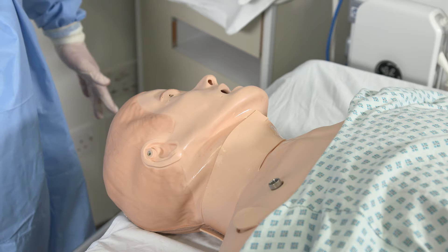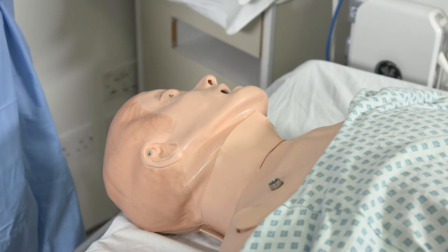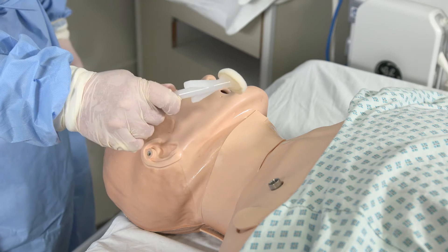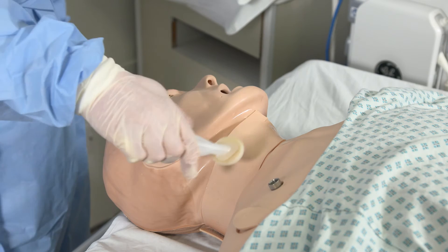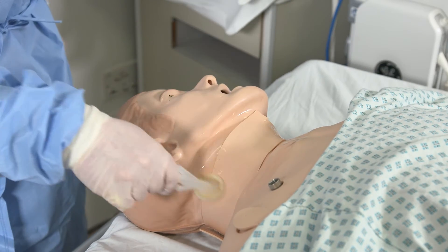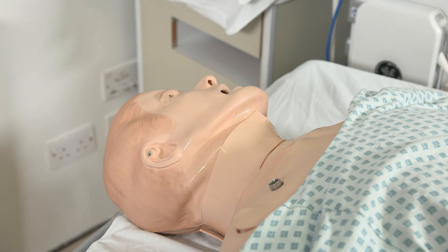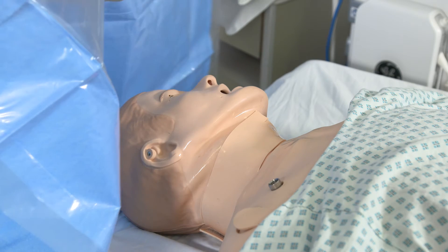Once you have positioned your patient and had a quick scan with the ultrasound to check the patency of the vessel, scrubbed up and set up your equipment, the next step is to clean the site with a 2% chlorhexidine lollipop. Clean a wide area around where you are going, allowing that a little bit of time to dry, then place a sterile drape over the patient with the long end down towards you.